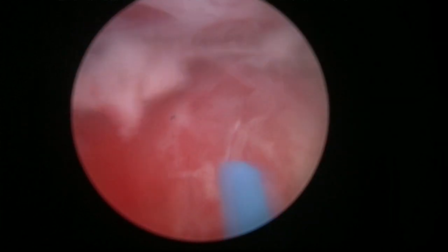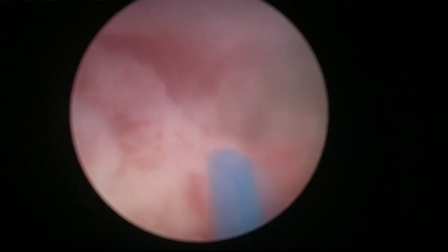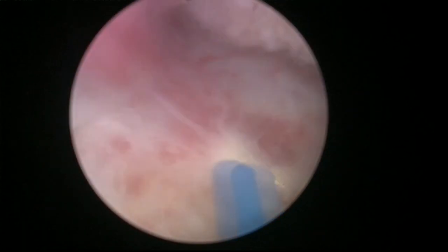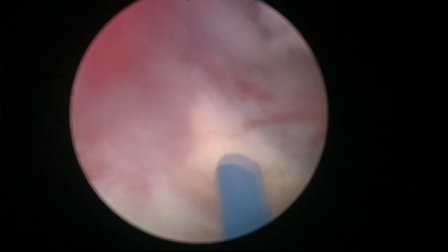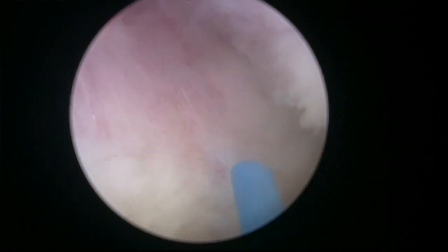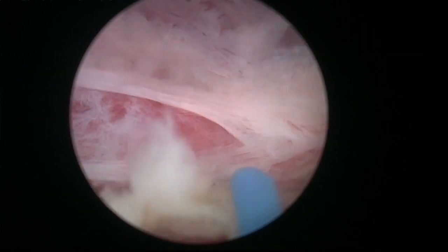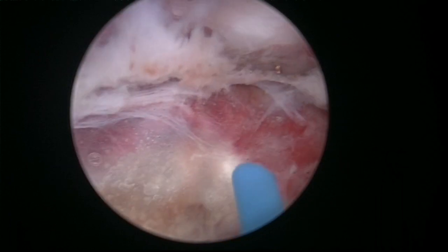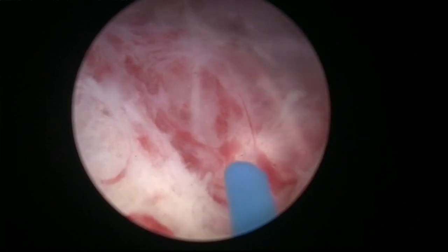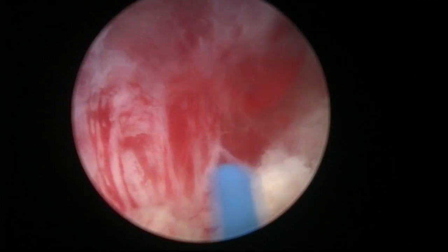You see, I'm playing with the distance, because this is the same setting, the 250. I'm playing with the distance to get a coagulative effect that is not aggressive. Sometimes when you have a very flimsy, very thin capsule, by trying to coagulate, if you get too close, you can cut open the plane or the capsule. So you have to get very good sensitivity and develop this sensitivity so you can tailor the laser effect on the tissue depending on the clinical scenario.